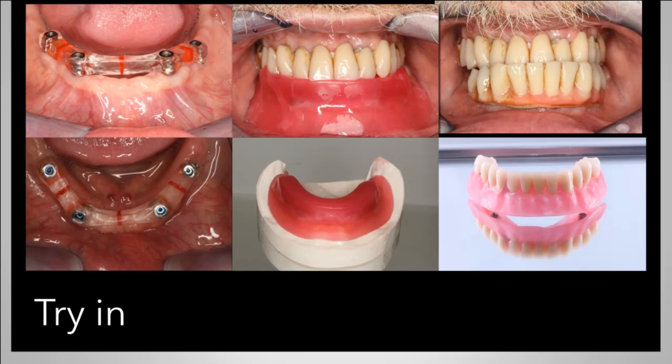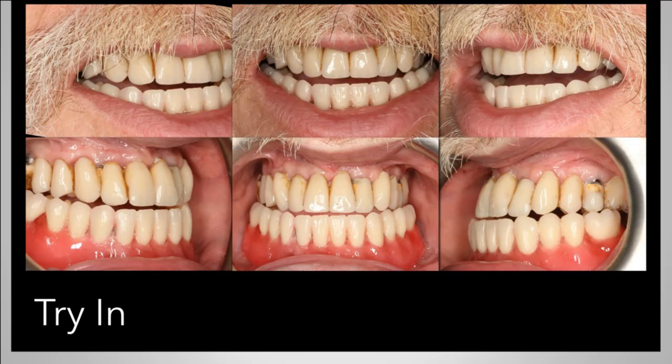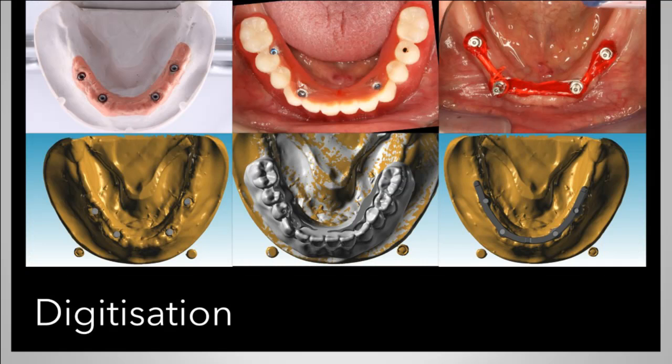So that's the verification jig, that's the bite registration, that's the try-in that we've constructed there. That's the patient with the try-in in place. A few changes have been needed. We've carried out the changes, and what this has meant is we've been able to then go digital.